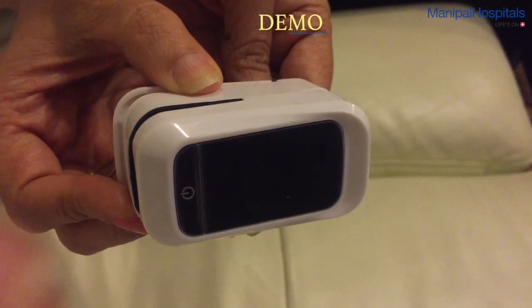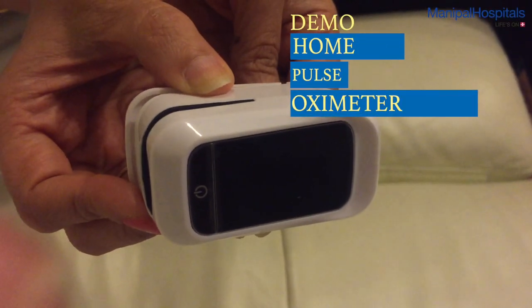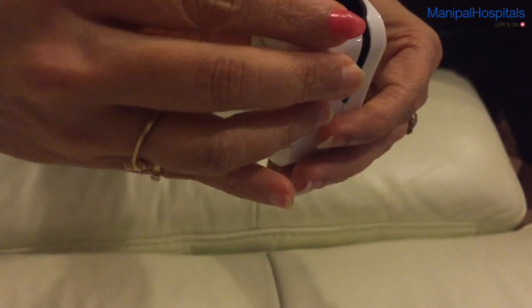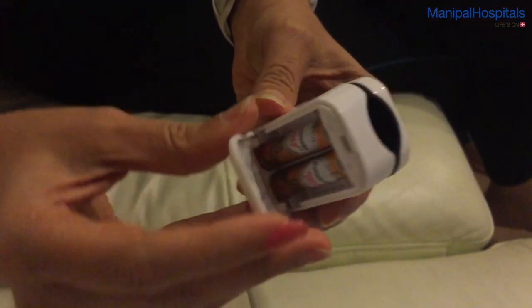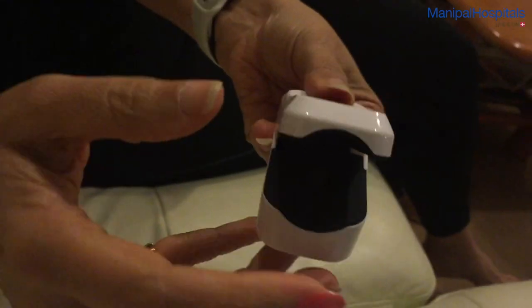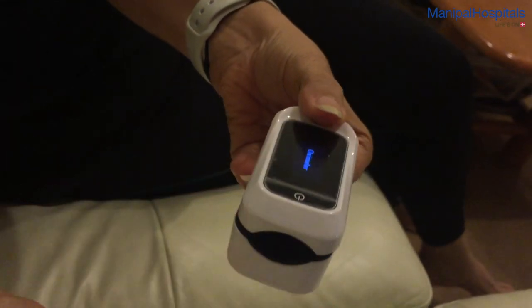Viraj and I will demonstrate the use of a home pulse oximeter. This is the machine — it's battery operated and has a battery chamber at the back which houses two AAA batteries.